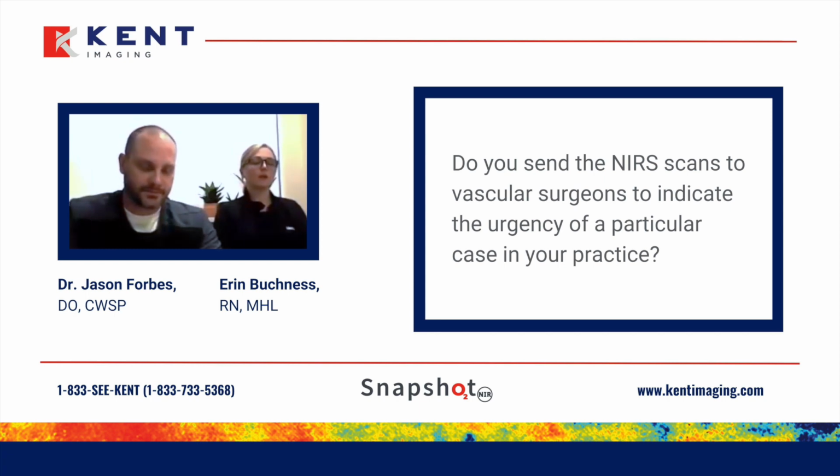Amen. I wish I had a percentage, but say we send 5 patients to vascular a month, I would say about four of those 5 patients are receiving some kind of intervention or have a history of needing an intervention and need further vascular surgeries or what have you. So really that time, like Dr. Forbes touched on, that time wasted is not there, because we already have that data, that proof showing, okay, this patient probably will need further workup, arterial Doppler, and possibly OR time.